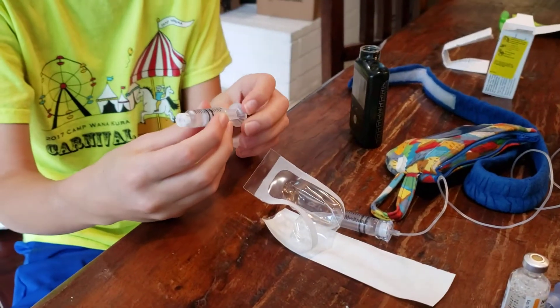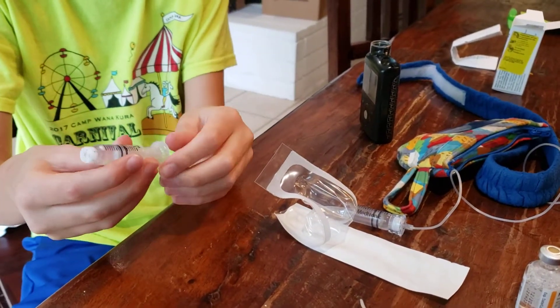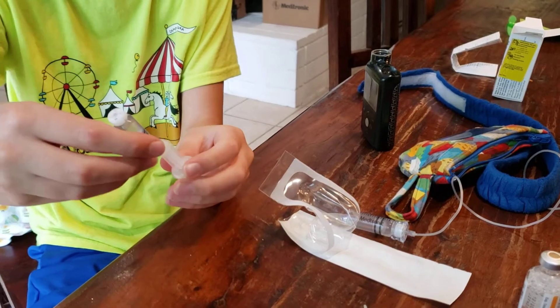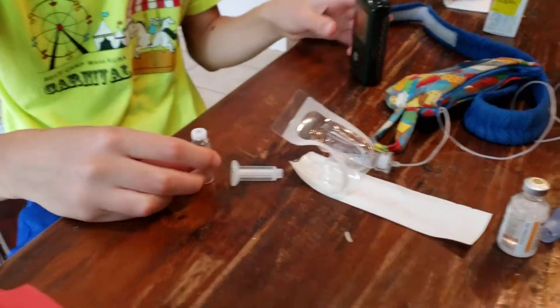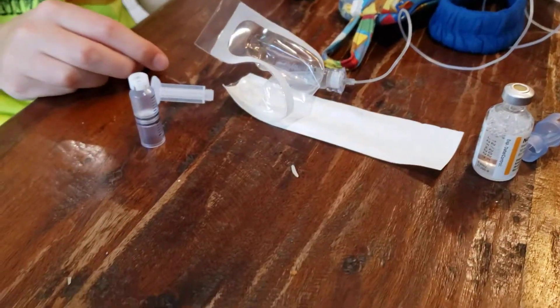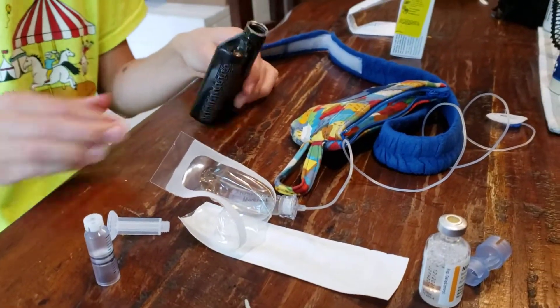Aiden did it perfect. You have to unscrew the thing — you have to turn it to the left. And then after you're done with that, perfect.